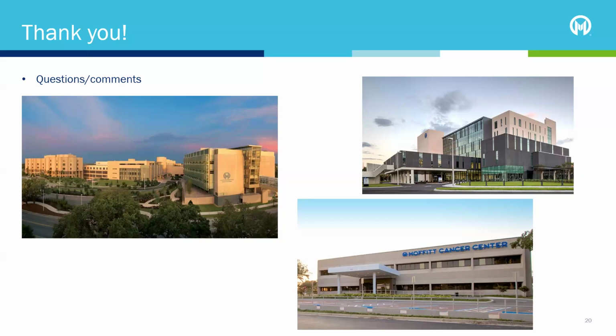Sure. Thanks, and great talk. So PET scan for well-differentiated neuroendocrine tumors is good for telling us where the tumors are, but not so great at detecting changes in size, especially small changes in size. CTs or MRIs are better for that. PET scans can be useful for, first of all, a baseline staging, just so we know where to focus our future CT or MRI scans.